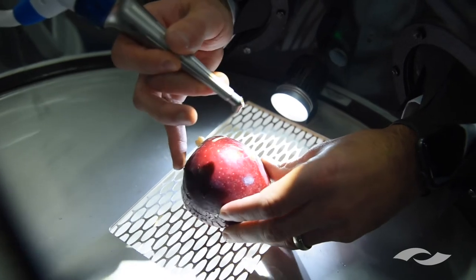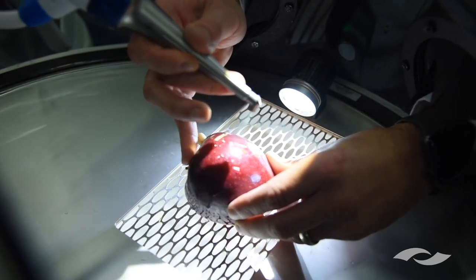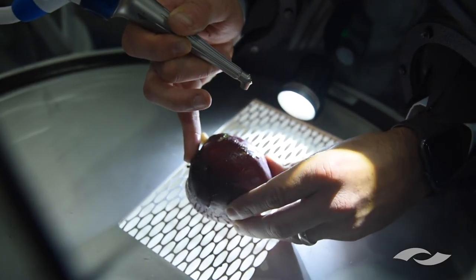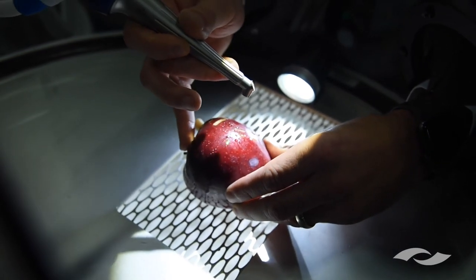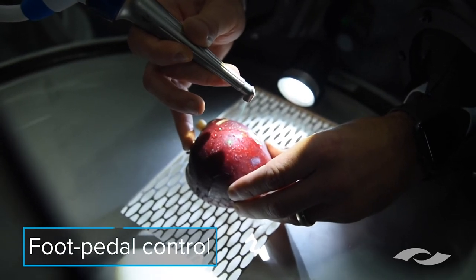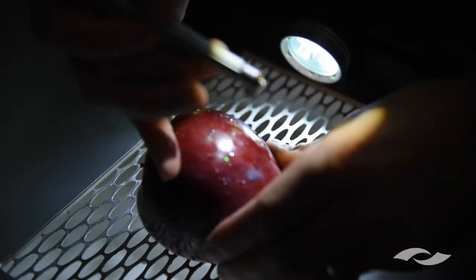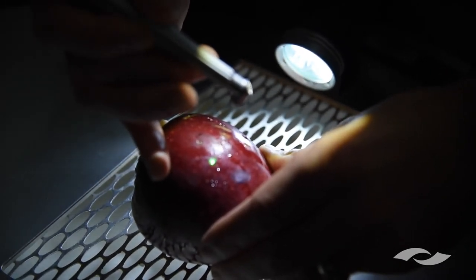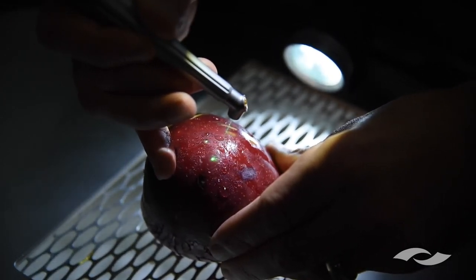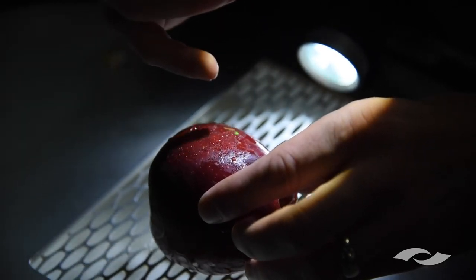With soft tissue, you have the specificity and uniqueness to be as gentle as removing only a very thin layer — like the skin of an apple — similar to treating an aphthous ulcer. Notice I don't change any settings; just by varying the foot pedal, I'm able to not only remove that first layer, but go into that inner layer of tissue, similar to uncovering a dental implant. By only changing the spot size, I can give more energy and create an incision line for a flap. You have all this ability with the same device without changing anything.